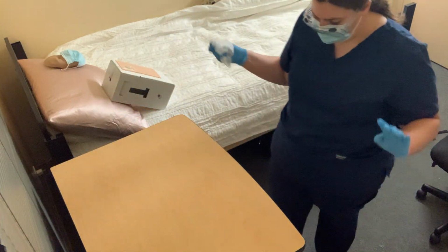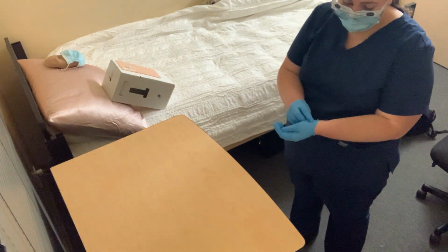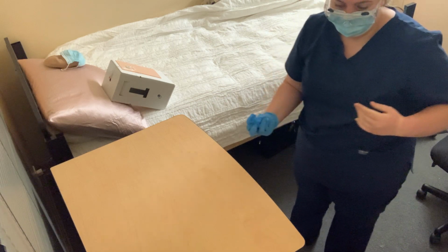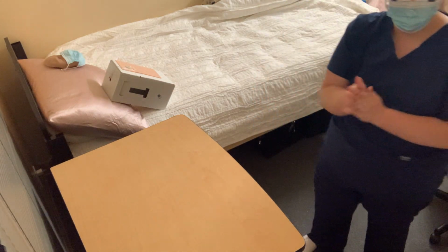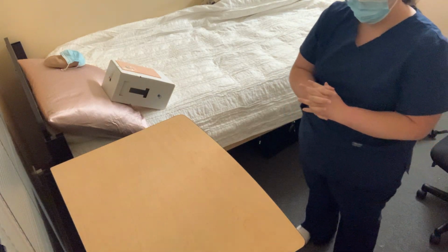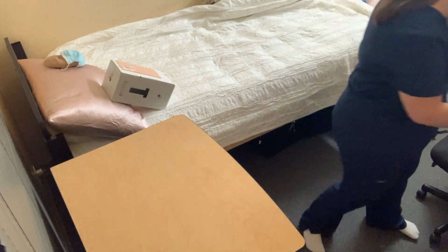All right, so it's been 30 seconds. I'm now going to let the table sit wet for a total of 2 minutes. This is in order to allow the solution to kill any bacteria on the table and also to allow it to dry. I'm going to do hand hygiene. All right, and now that it's been 2 minutes of the table sitting here, I'm going to go ahead and grab my supplies.